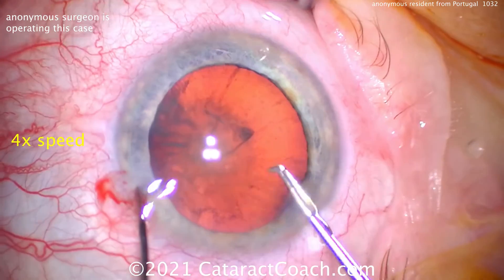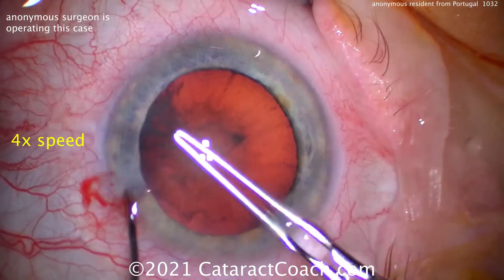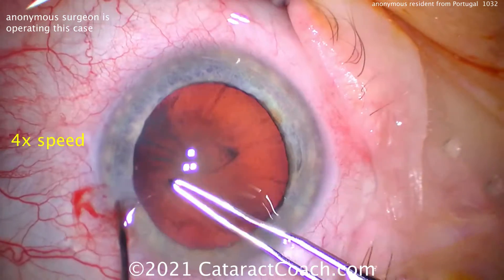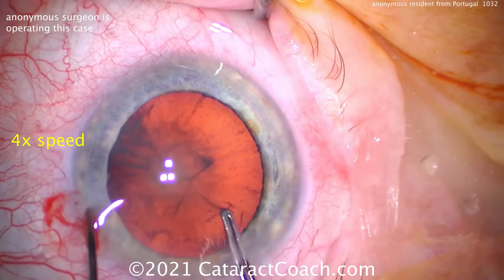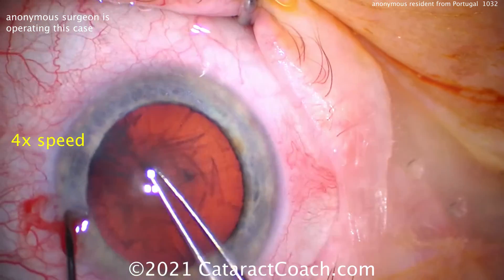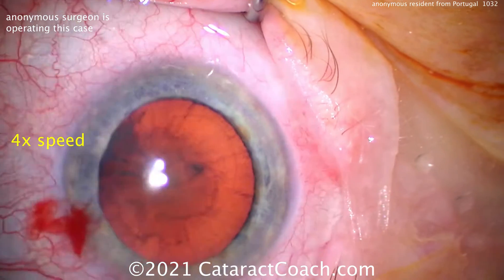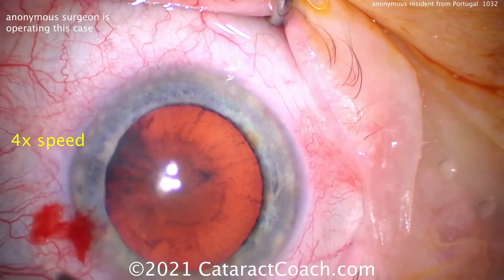Here comes the rhexis, starting with the cystotome and now doing the capsulorhexis. And that one's pretty good. Coming around — so a little bit on the small side. This is a capsulorhexis that is a little eccentric. So not the best capsulorhexis; that needs a little bit of work. For case 70, it's okay.